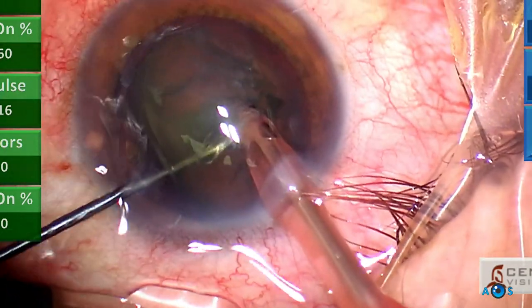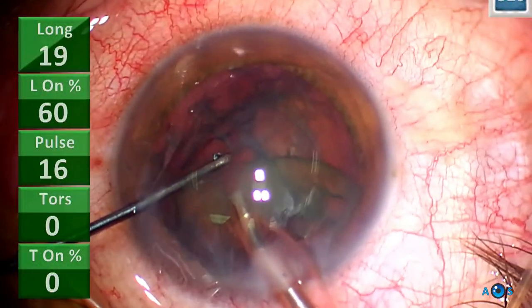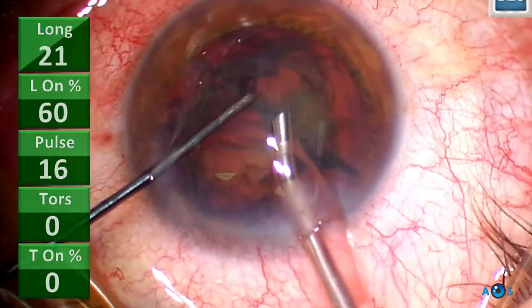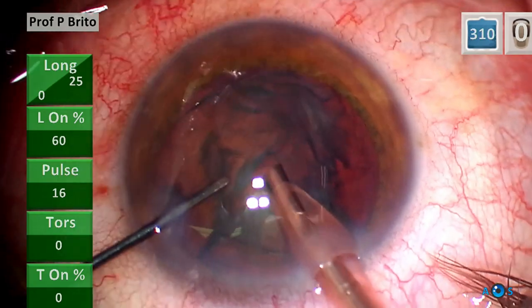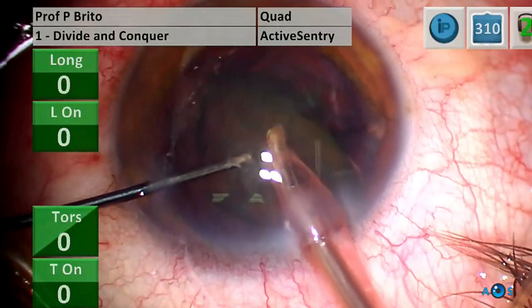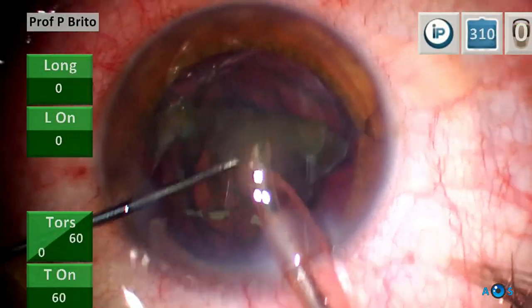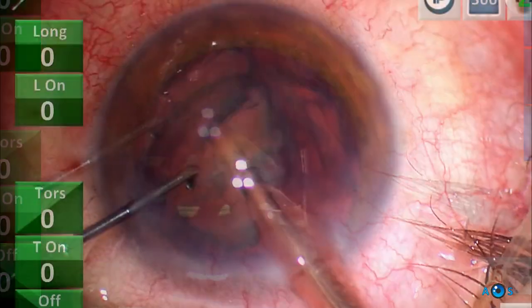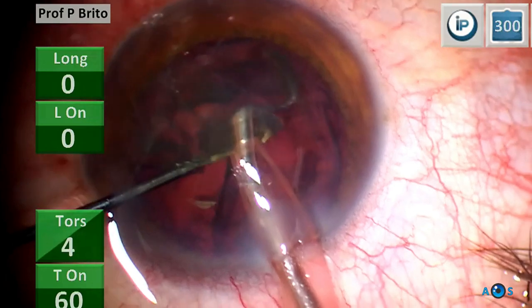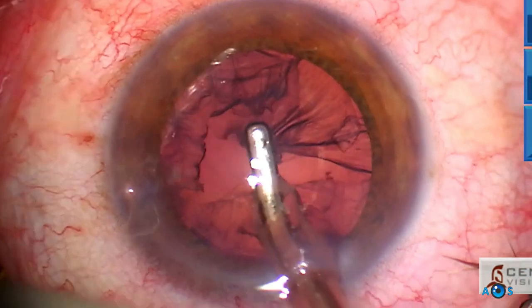The tilt and chop technique is again used for efficient phaco. The chopper is used to feed the nuclear halves into the phaco probe. As this is a somewhat soft lens, practically only aspiration is used. Ultrasound energy in such cases is just an auxiliary tool applied by lightly tapping the foot pedal on position 3. Nuclear emulsification is complete. Now time to switch to the I and A probe for cortical removal.